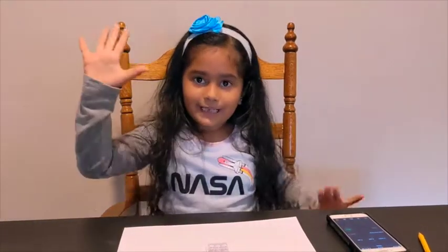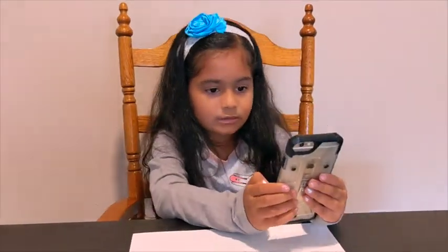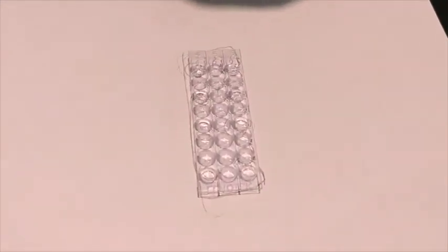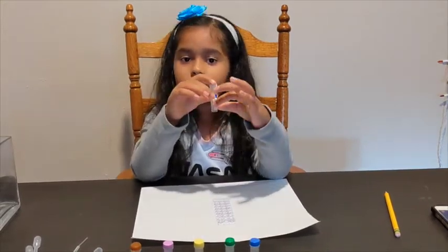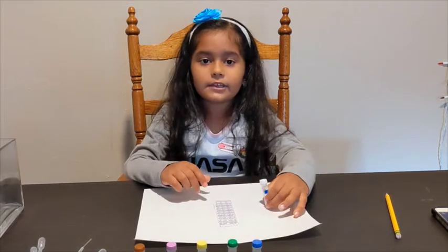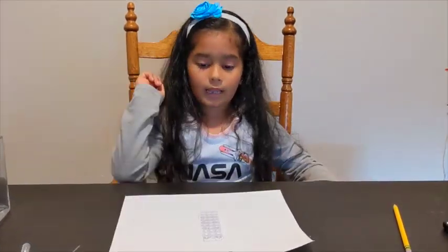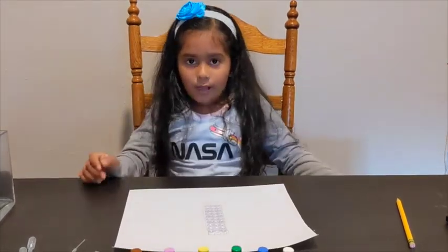We're going to wait for five minutes. I'm going to start my timer now. Time's up! Now I'm going to add two drops of negative control sample into my two negative control wells.